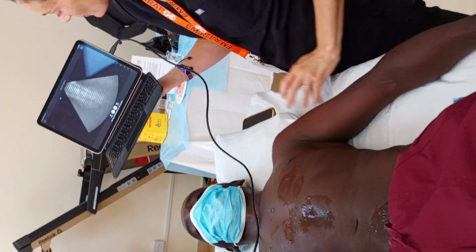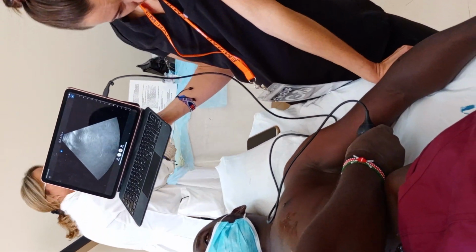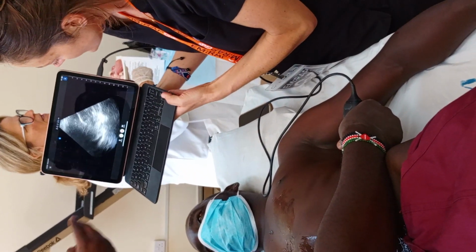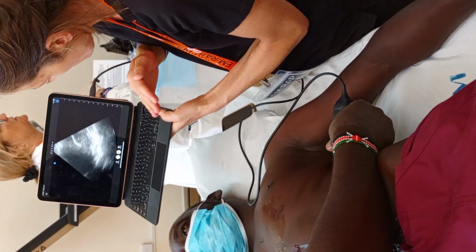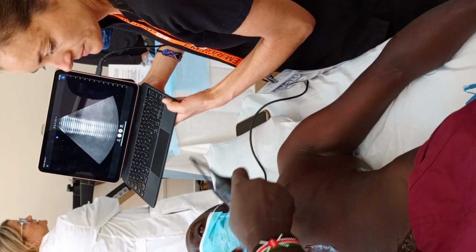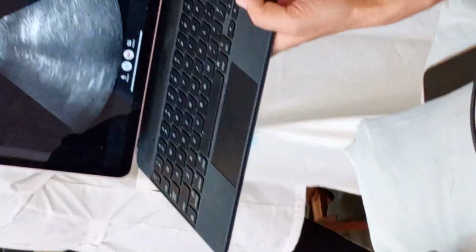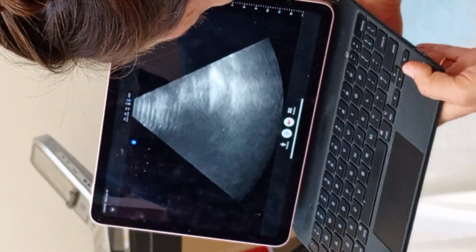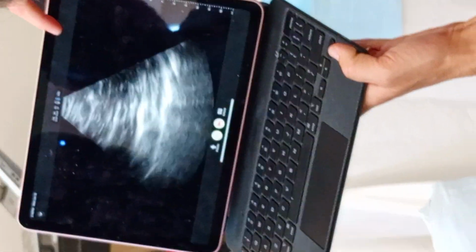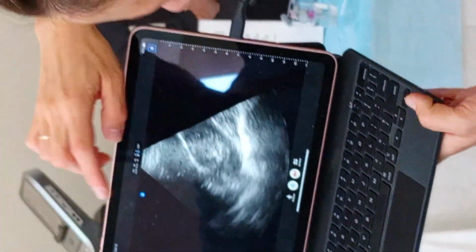All right. Left upper quadrant? Where's your indicator? Good. Upper quadrant. And it's actually almost a little bit difficult to pull off. Go a little bit more close to your eyes. Maybe a little bit more gel. Oh, we found some vertebra back there. Cool. This is a little too low. There we go. What's this? Spleen. What's this? Kidney. Beautiful.